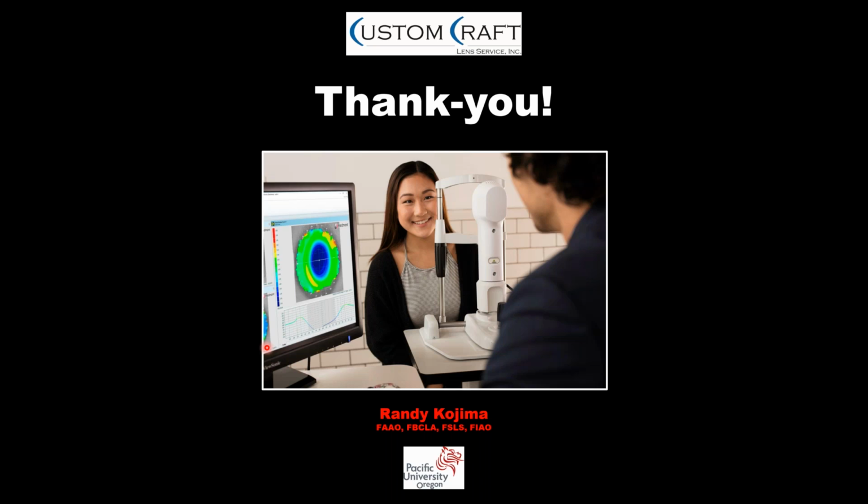Terrific. And what do you find is the best way to get the biggest capture for a patient with smaller eyes without getting in the way of the quality of the image? Do you want me to field that one, Darren? Yeah, I think you're certainly qualified as the expert in the field. It's so often that we're fitting ortho-K on kids, probably 98% of the time. So of course we're going to be dealing with smaller fissures, and then on top of that, many of our myopes are Asian and with small fissures. So how do we address that with any type of topography capture?